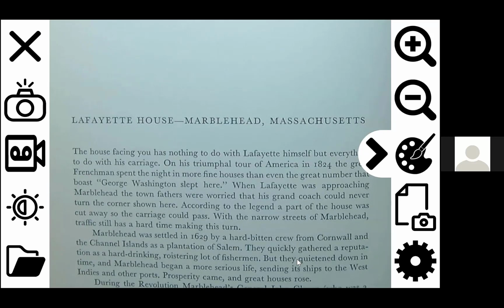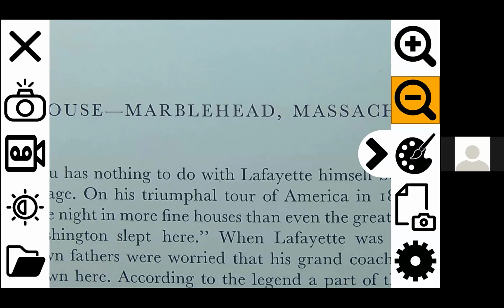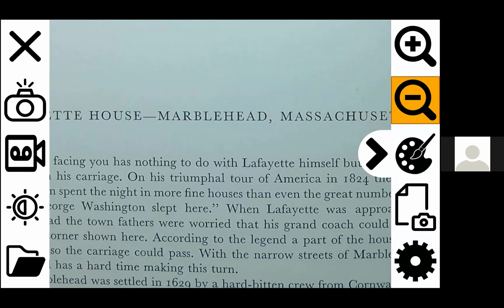So really nice, easy, self-explanatory. A lot of these options are here. I'm going to start on the top right, where you'll see the magnifying glass with the plus. If I click on that, there's going to be a little bit of a lag just because I'm going through Zoom. I'm using Zoom on that Surface Pro to push this out as well, so that's another nice feature you can do. By pressing that, I get my magnification in. Obviously, pressing the minus, I'm going to get my magnification decreased, or zoom out.